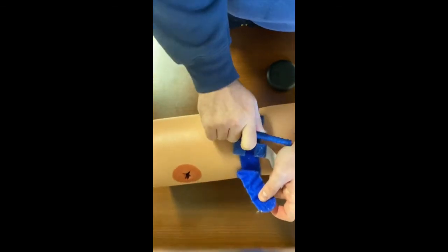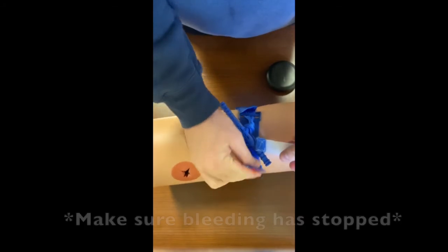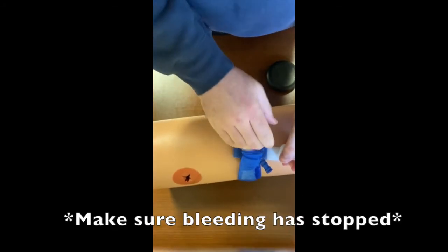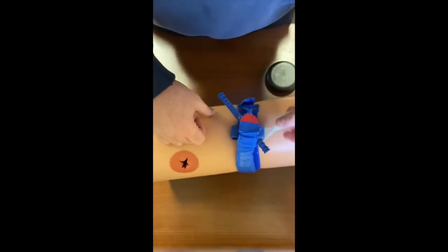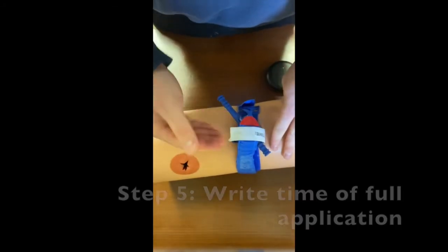I think I can get one more pass on this. I can. And it's going to tuck nicely into there. I'm going to put that down so that we're ensuring that our tourniquet is nice and tight. Finally over with this to lock everything in place. Mark the time.